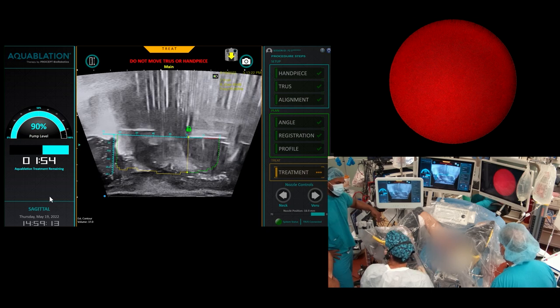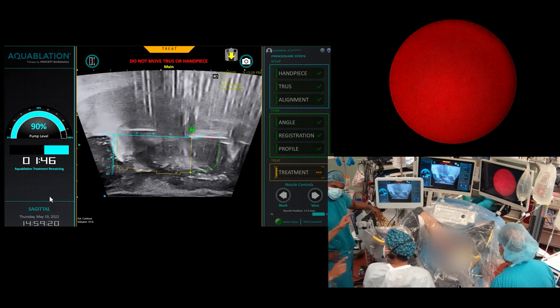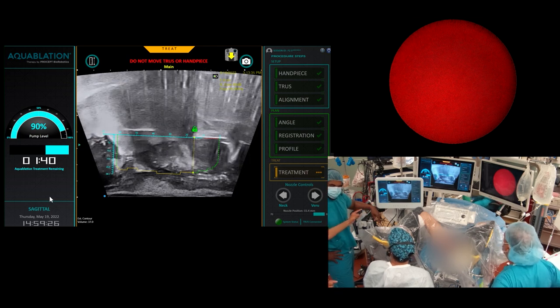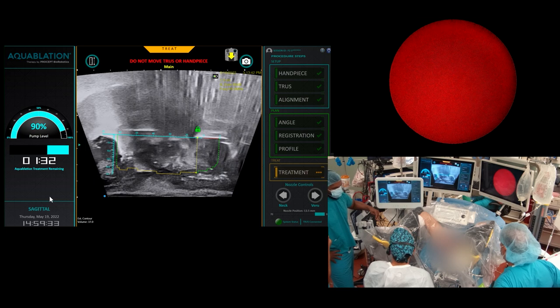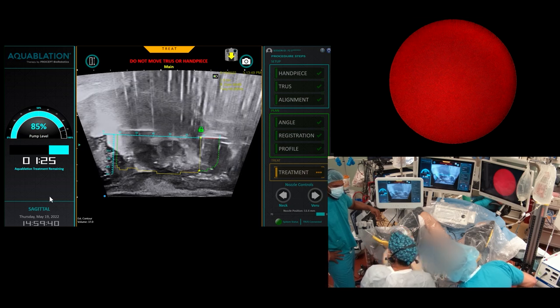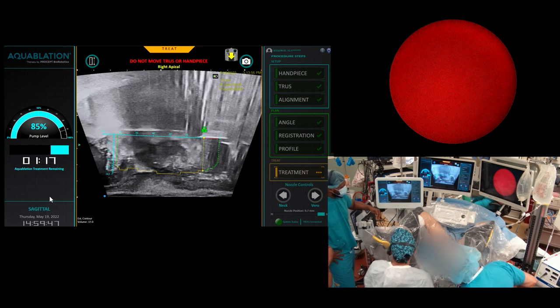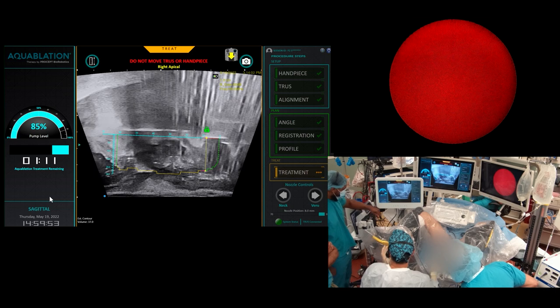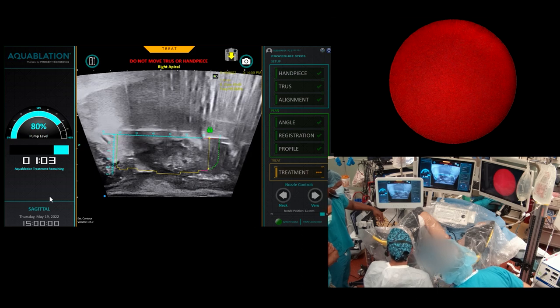This will be a two-pass total — done. Like a 280-gram prostate in 25 minutes. How can you compete with that? No technology or modality can — open simple prostatectomy, robotic, TURP, green light. This is as efficient as you can get with your time. I want to put that on a slide. Is the eventual upgrade going to change the length capacity beyond six centimeters? I don't think so. How it's set up covers 95% in one pass — there's not really a need for it.